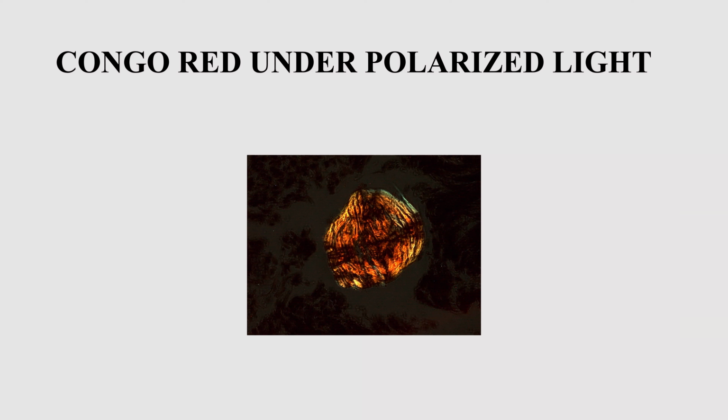This is not a big amount of this phenomenon, but the main phenomenon is in this sample. It's a sign of a Maltese cross.